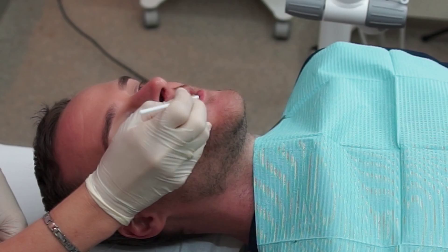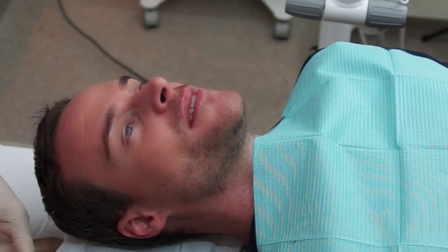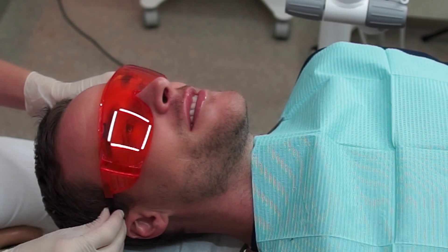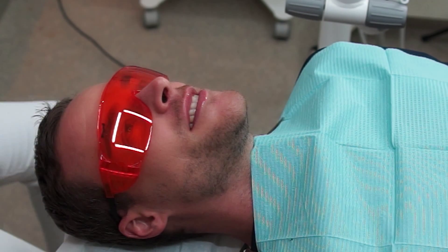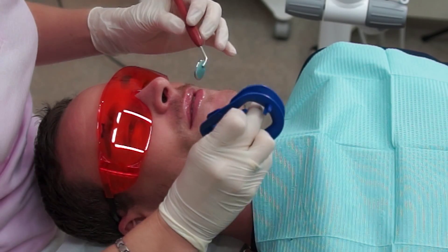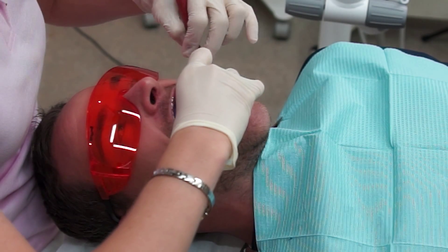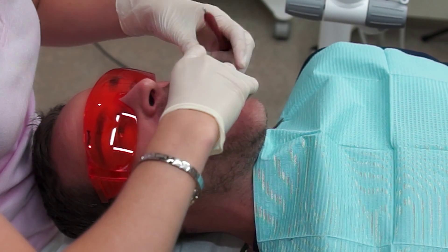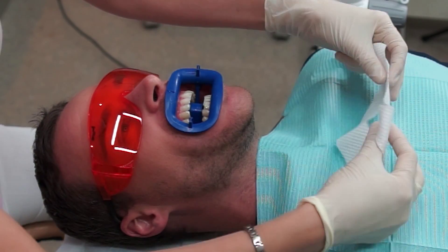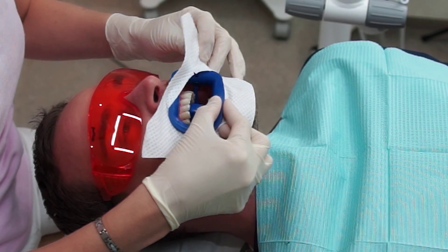The procedure starts with moisturizing the lips in order to place a retractor. The patient is provided with protective eyewear, because the light source should not damage the eyes. The area around the retractor is also protected because when the gels are applied, you don't want it on any facial tissue of the patient.